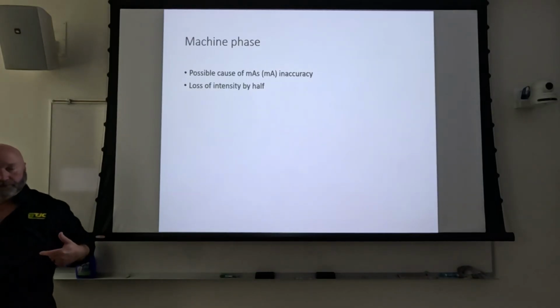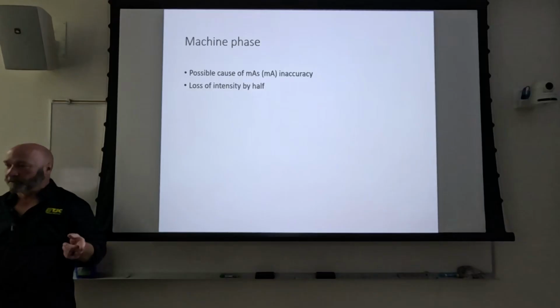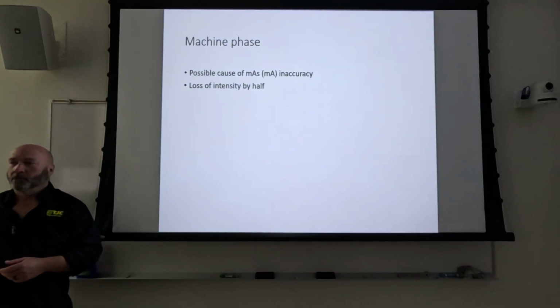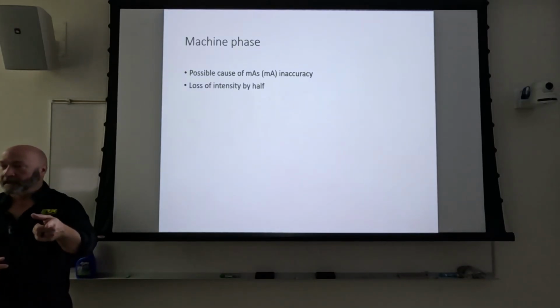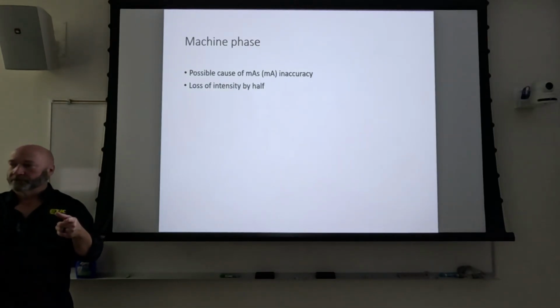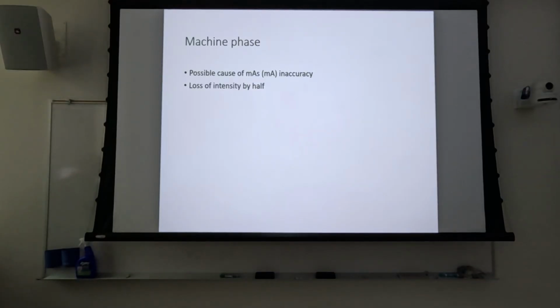So you make your exposure, they detect the radiation, send a signal over to the timer circuit to kill exposure, right? So what's going to happen if you phototime? It's going to be a long exposure. Going to give more exposure, exactly. Instead of being half the exposure, you're going to get twice the time, right? So either one of those two things can happen with your rectifiers.